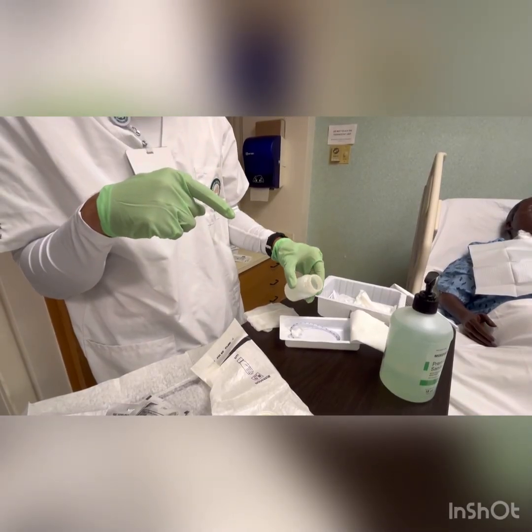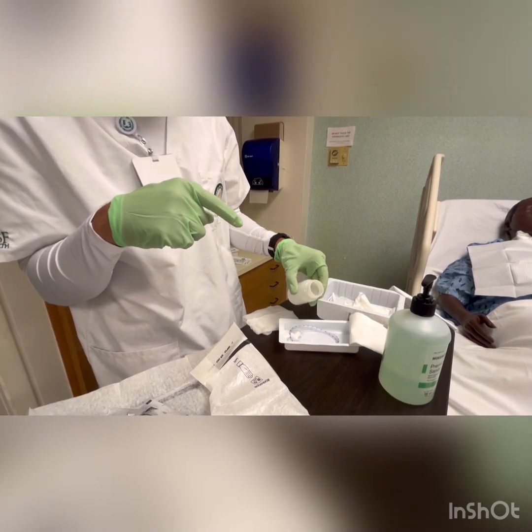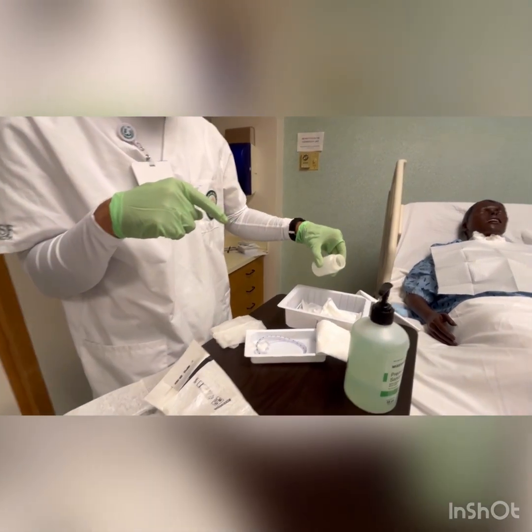Next, we would pour the sterile saline into a sterile container using the non-dominant hand.